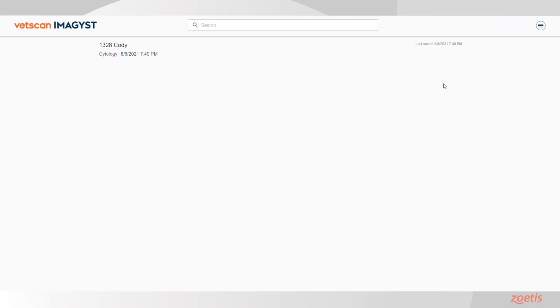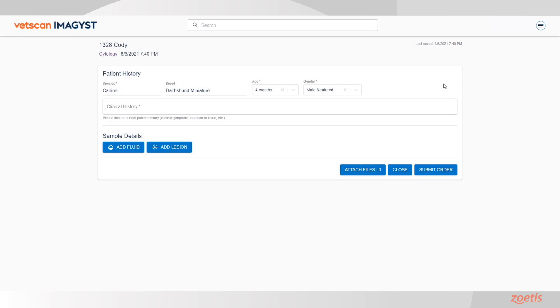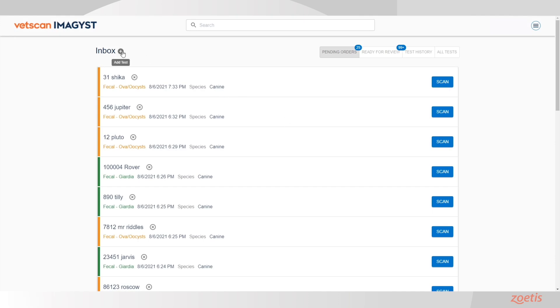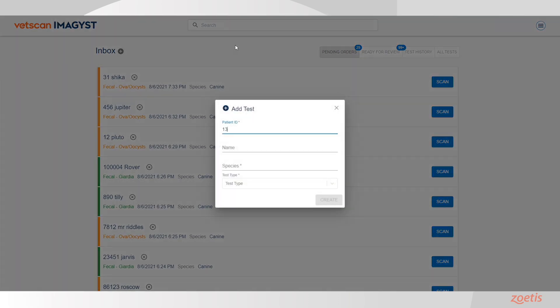Select Start for the correct sample. Sample information will become pre-populated from any fuse-connected software system. If no integration is available, select the Add New Test icon. Enter the required information and select Create.